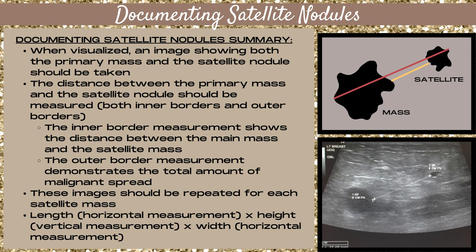It's not important which scanning planes you take your measurements from. You can take two measurements in antiradial and one in radial, or do the opposite, as long as you've covered all three measurements. You want a length measurement, which is your horizontal measurement, a height measurement, which is your vertical measurement, and a width measurement, which is also a horizontal measurement. The biggest mistake new sonographers make is taking two height measurements — two vertical measurements. Always ensure you have two horizontal measurements and one vertical measurement when measuring masses.